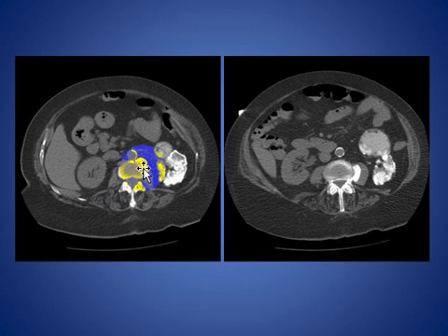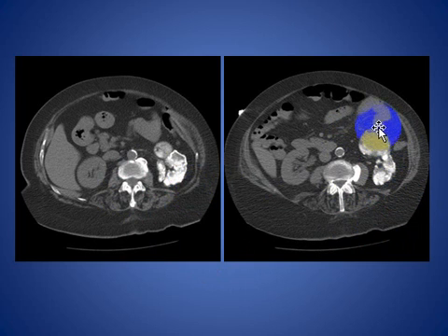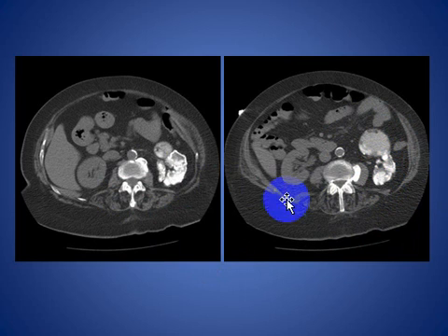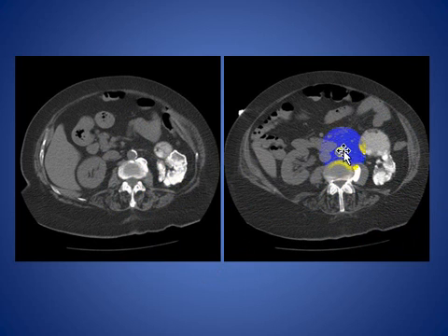Here you see calcification involving the left kidney. This is due to tuberculosis, causing autonephrectomy. You also see incidental calcification involving the aorta.